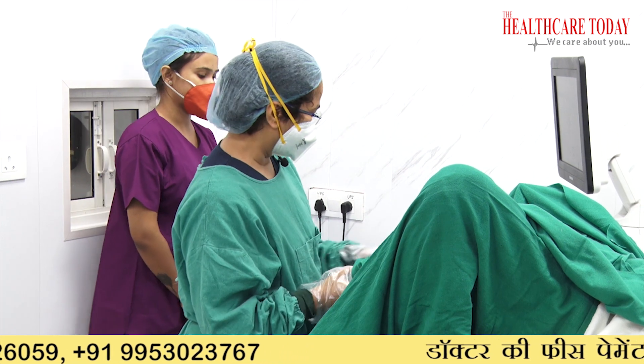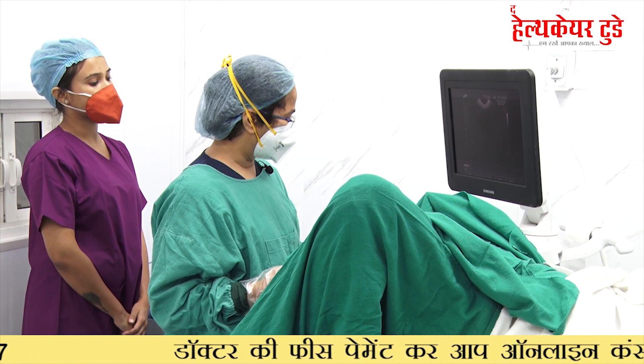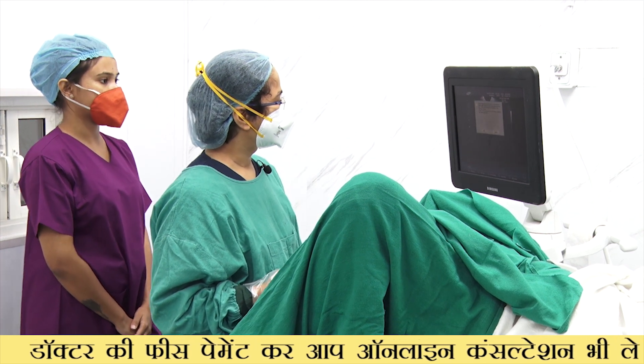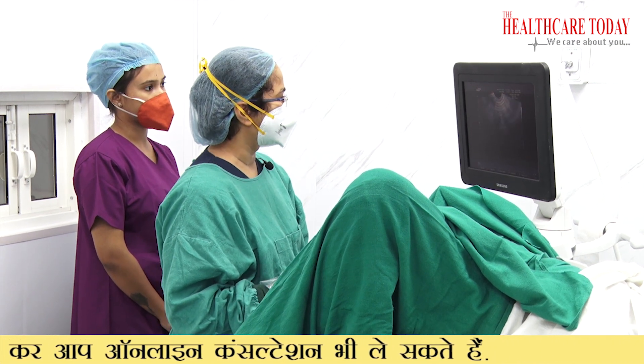Now we start the procedure. This is the ultrasound machine and this is the screen. You also have to put the biopsy guide on — there is a setting for it. The procedure is now guided; you can see everything on the screen, including the eggs.